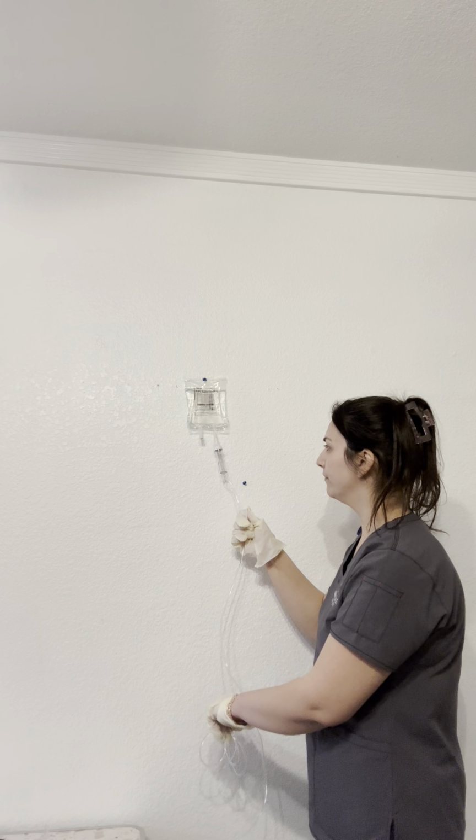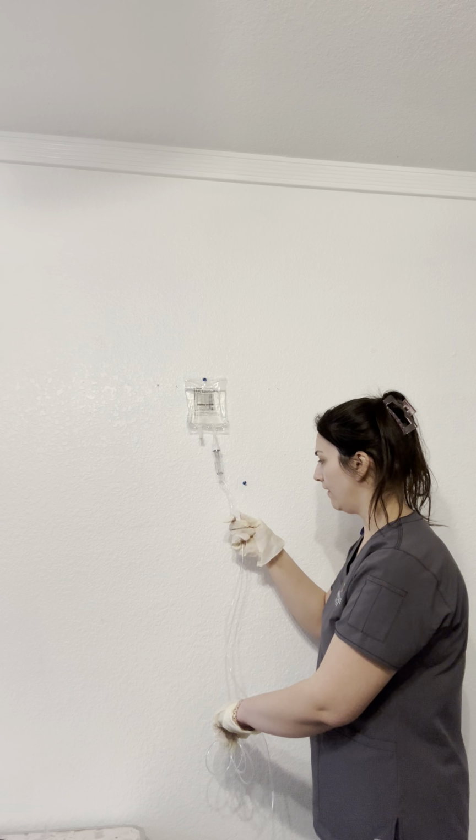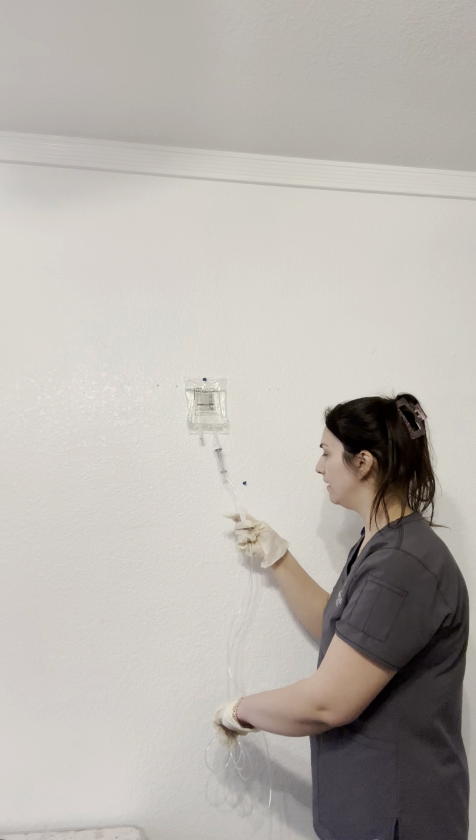Okay, awesome. So I have done that. I'm going to clamp this.